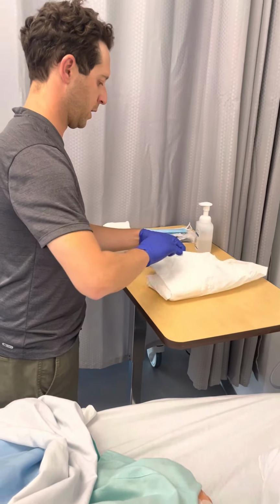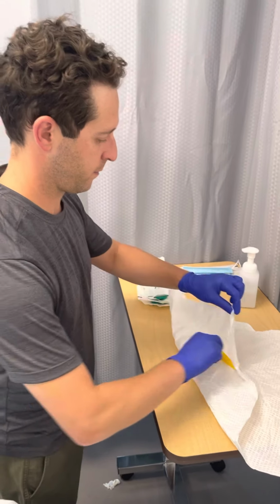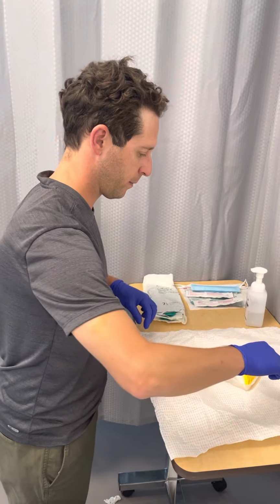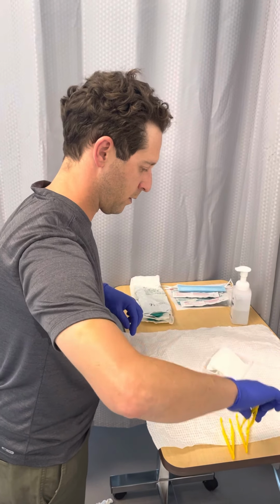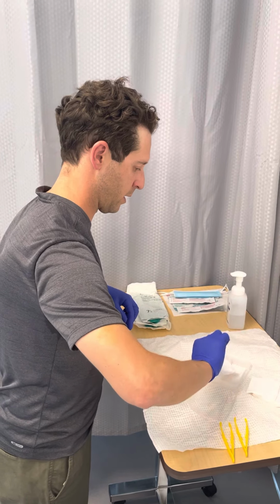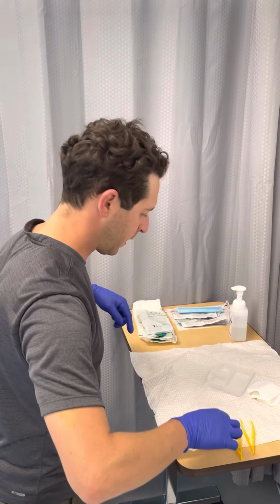Out of the package. Touch that, make sure to pull it back on. Now I also want to do hand hygiene before I put on my sterile gloves. Good. And a garbage bag. I have a garbage down in the base there.